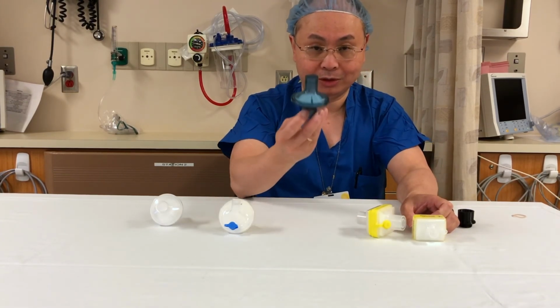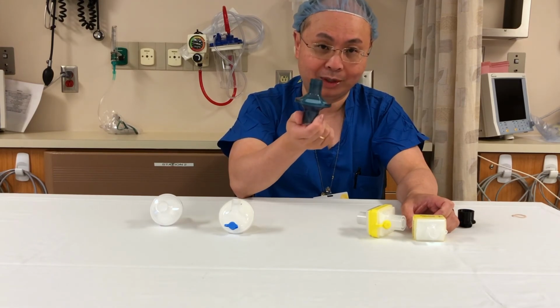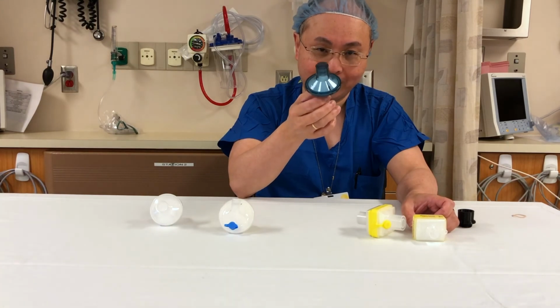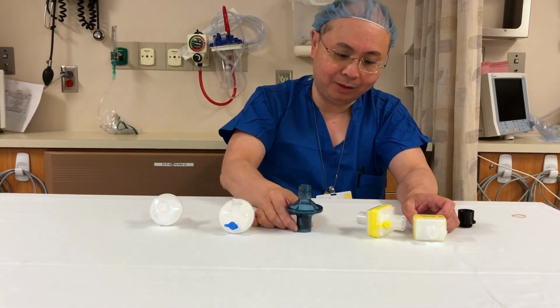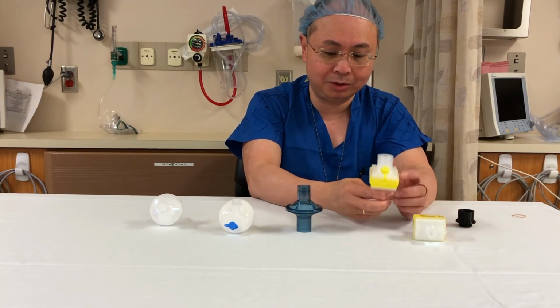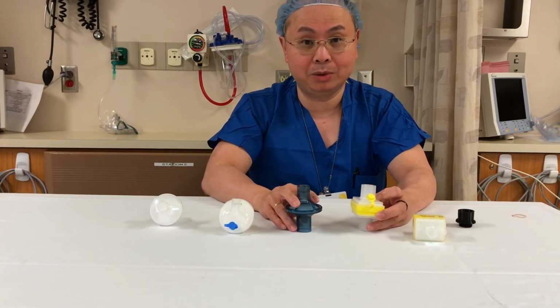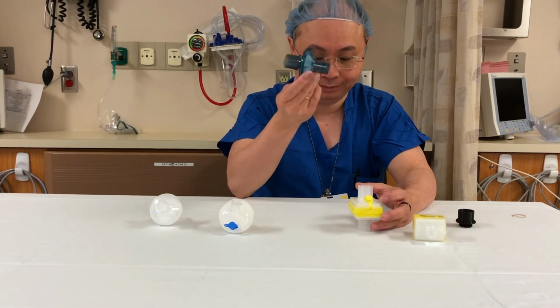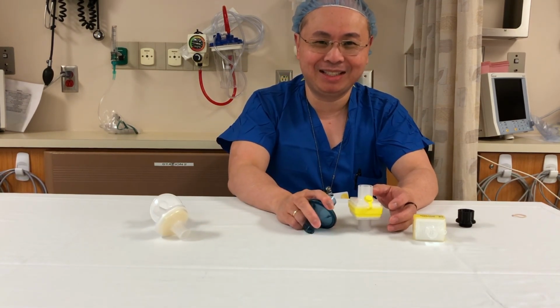So if you have a choice, get one that has 1.5 centimeters water resistance at 60 liters a minute. You can go up to 2.9 and still be okay for the average size user. If you have a 100 kilogram user, you're going to want a filter like this. So that's it for filters.